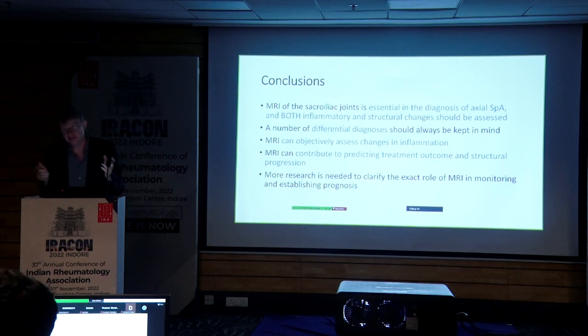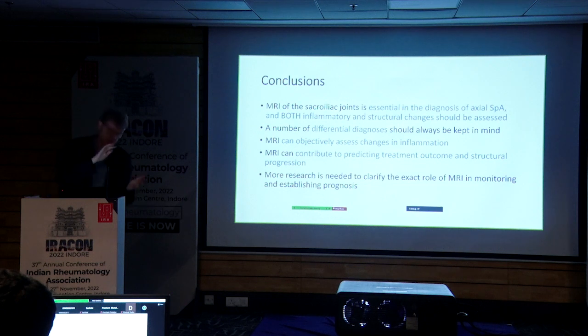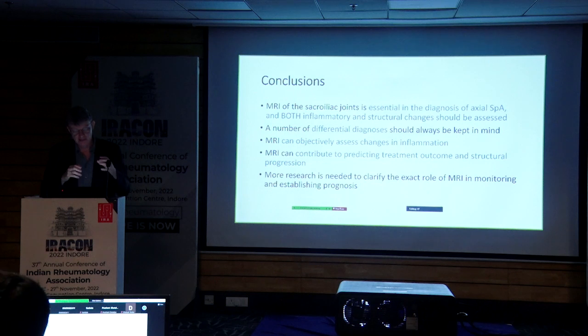You still have to think. Sometimes you have to say, okay, it could be, but it's not really convincing. Perhaps you can come back in a year if you're still feeling pain, in the milder end. It happens, but it still helps you a lot.